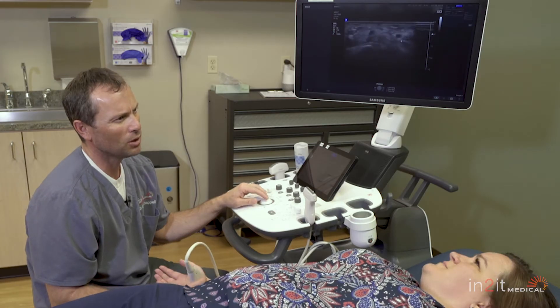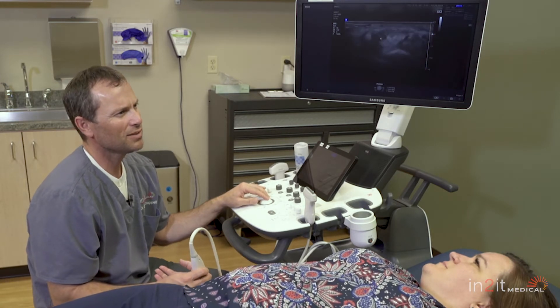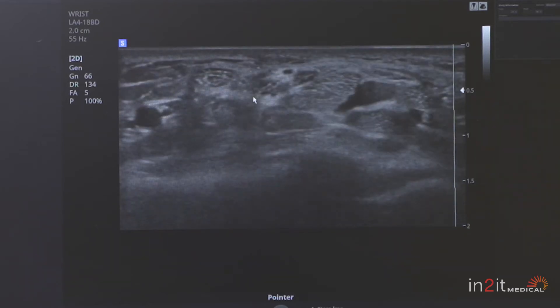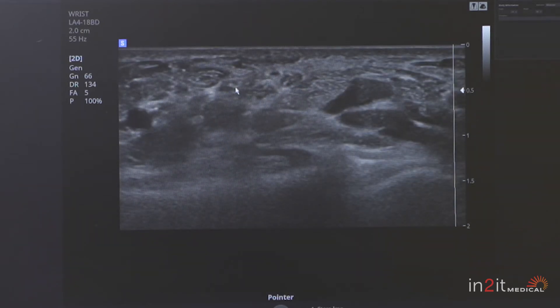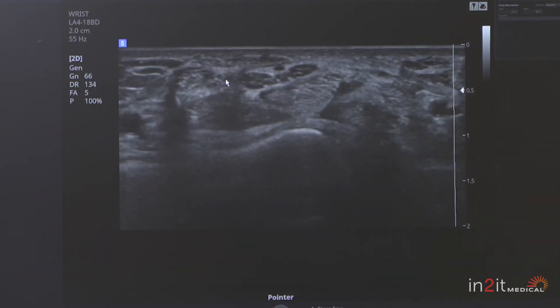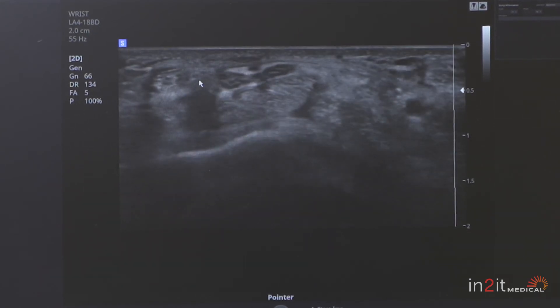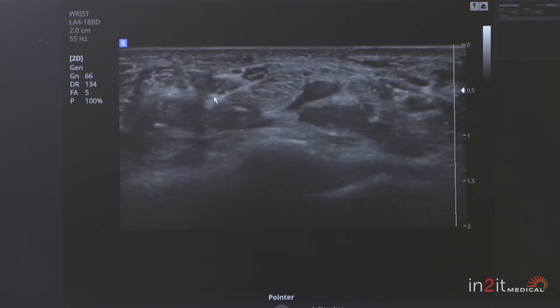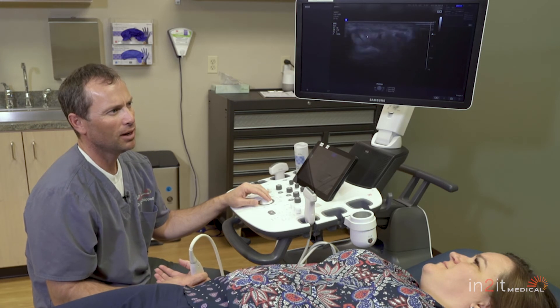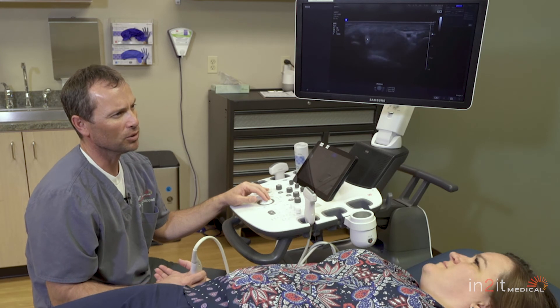The diagnosis is now made easier through the use of ultrasound because we can see the structures that we want to see. We can see the structures that we don't want to hit, which include the ulnar artery and the ulnar nerve, and we can ensure that all these structures are out of the way. As we follow this nerve back down towards the hand, you'll see this little black dot leave the nerve — that's the palmar cutaneous branch. That's the most likely nerve to be injured during a common carpal tunnel release. I can now see that nerve and ensure that it doesn't become traumatized or cut, which makes this procedure safer with fully guided carpal tunnel release.